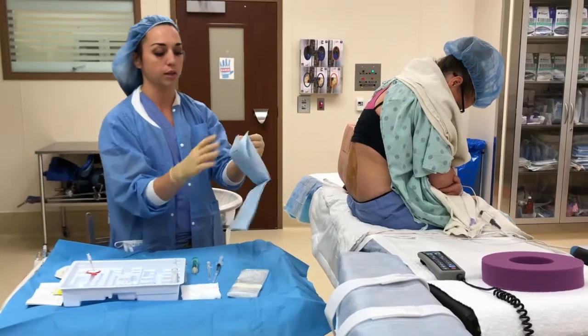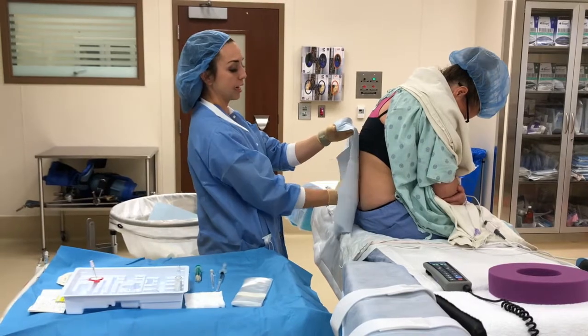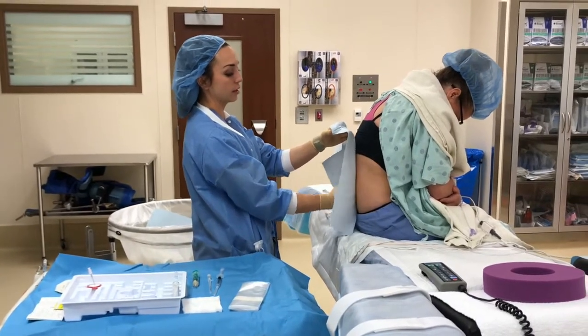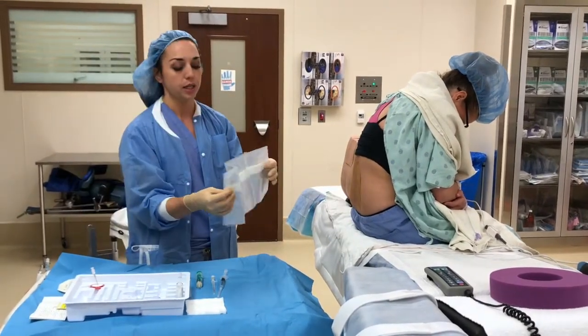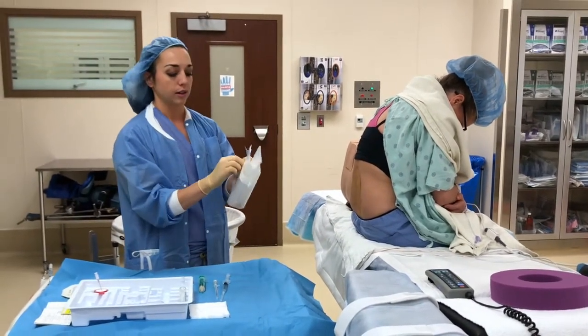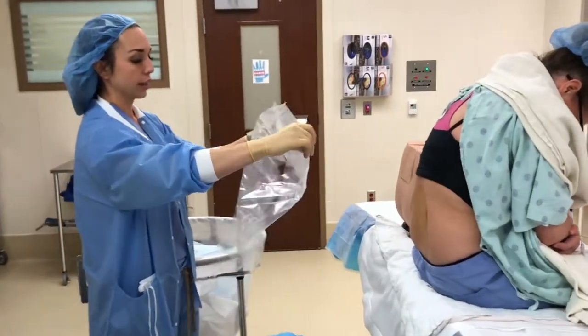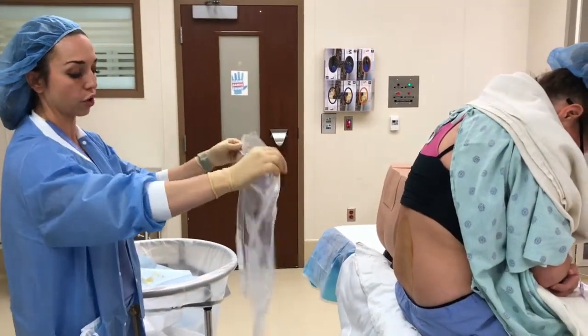The towel, same thing with this drape. Protect anything that's sterile. Dab, dab, dab with the back of your hands, and discard. The drape, again, is another thing that everyone opens a little bit differently. This is how I open it. I do partial like this. Gently allow it to unfurl.